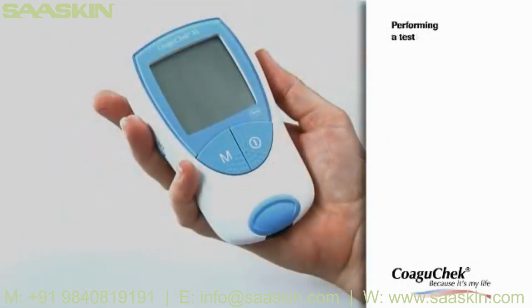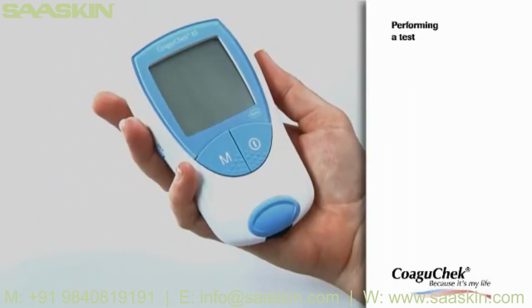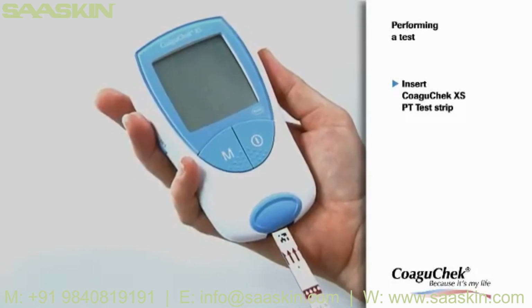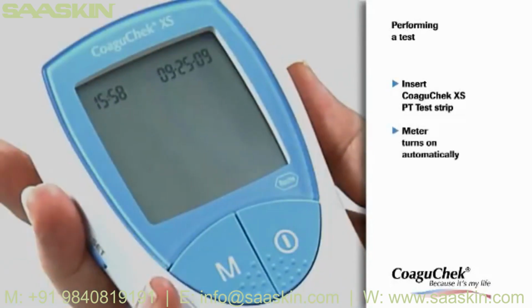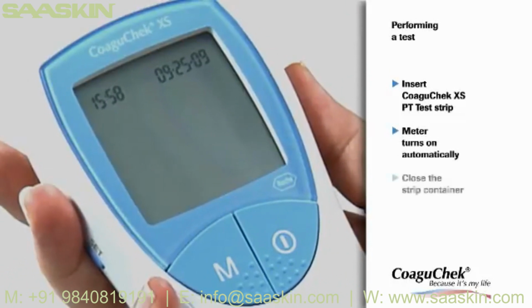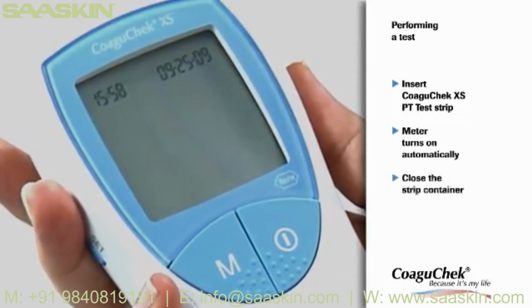Place the meter on a level, vibration-free surface, or hold it in your hand so it is roughly horizontal. Insert a test strip and hold it so the labeling is facing upwards. As you will see, the meter turns on automatically. Please remember to close the strip container again.